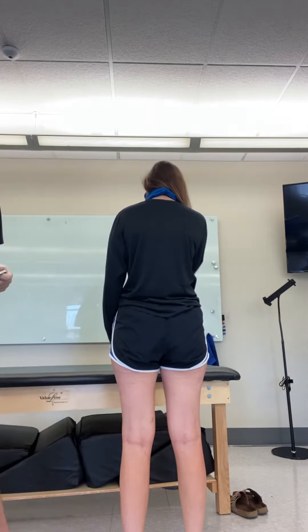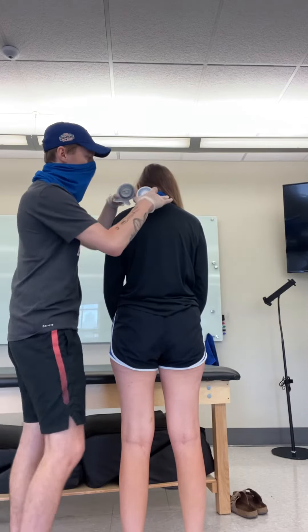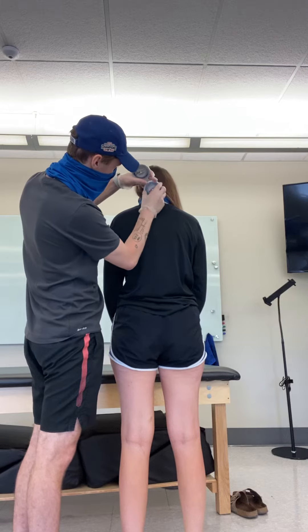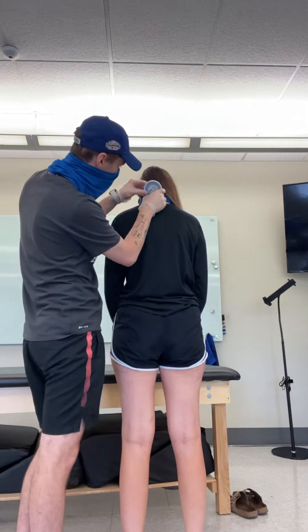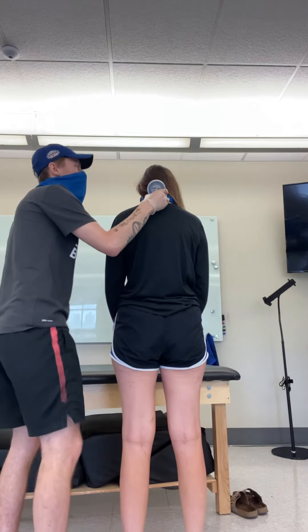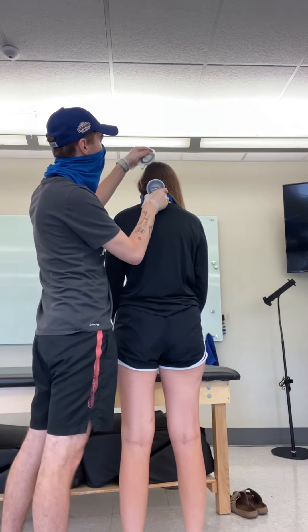For lateral flexion, you're going to have the inclinometers in the same place. Find that C7 and balance it out. And then you're going to put the other one on top of the head and balance it out.